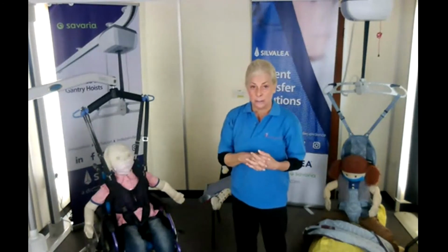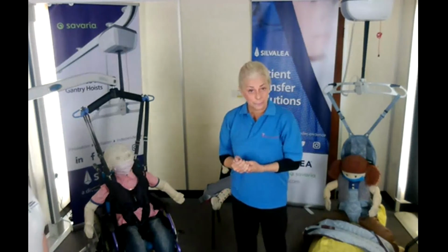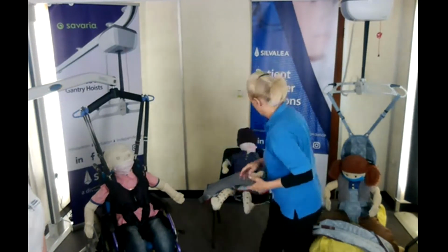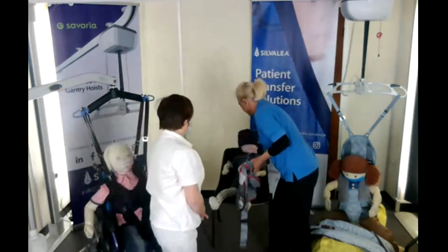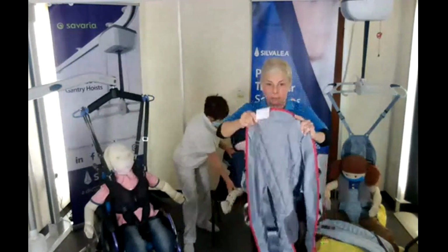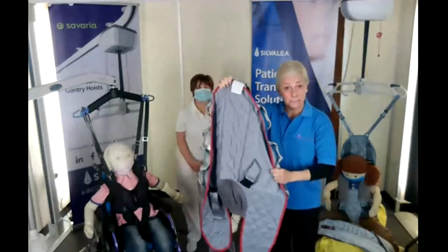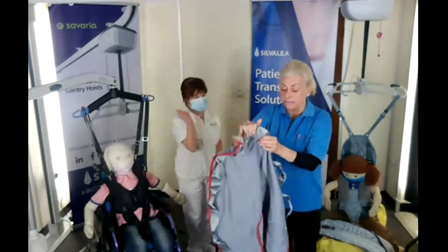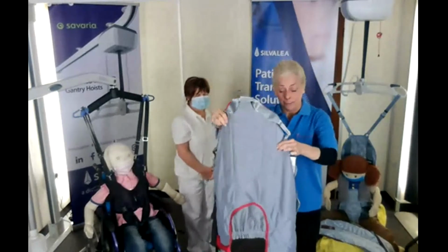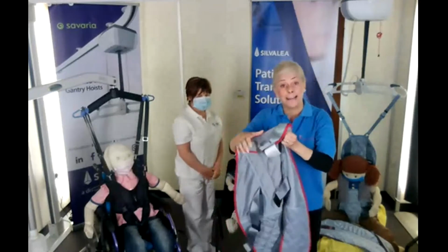So often in an emergency, if someone's fallen down, you can't get a hoist in, then we've got a manual product used for travel, things like that. But the little manual transfer sling looks like this. So it's the sling shape without tapes, made in polyester. It does have stiffeners or bones down the back on either side for support, little waist support there, and then positioning handles all the way round.